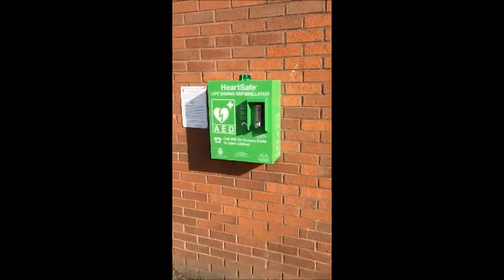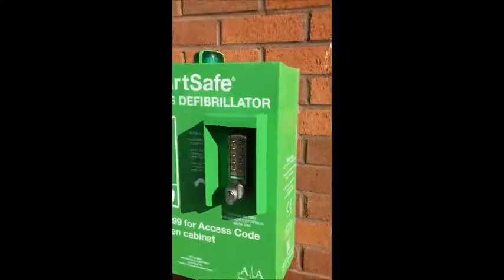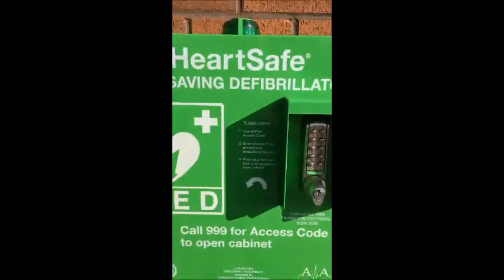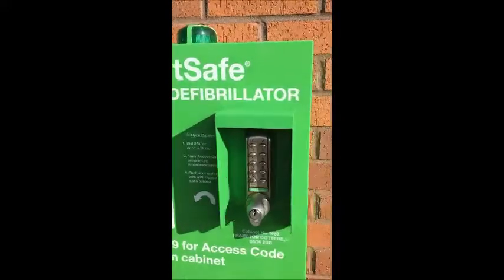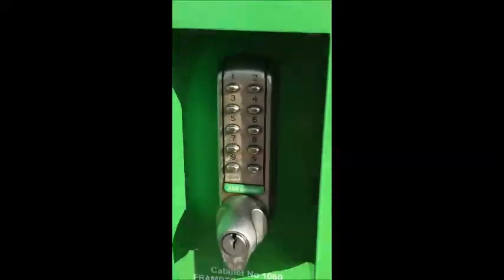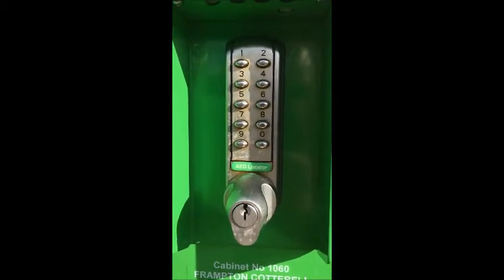We're going to be doing a guardian check on a heart safe cabinet fitted with a digital electronic lock. The first thing we want to do is check the cabinet all around, make sure everything looks okay, and then we're going to be entering the four digit access code into the keypad of the lock.